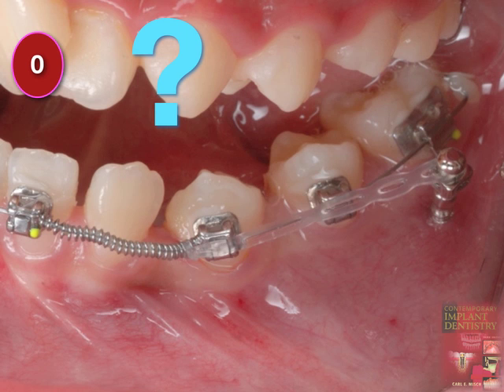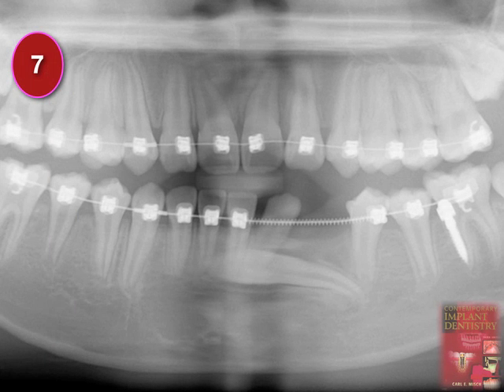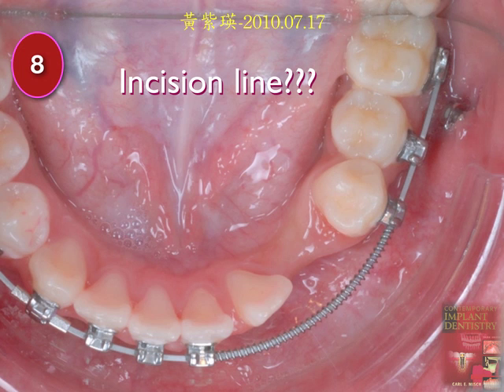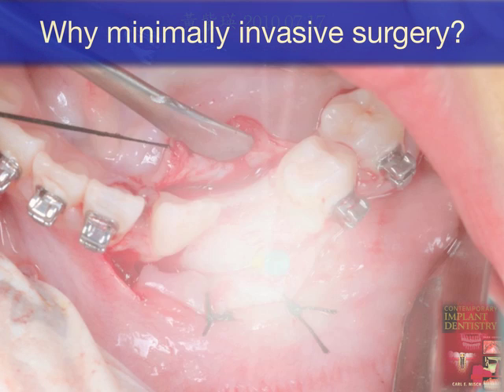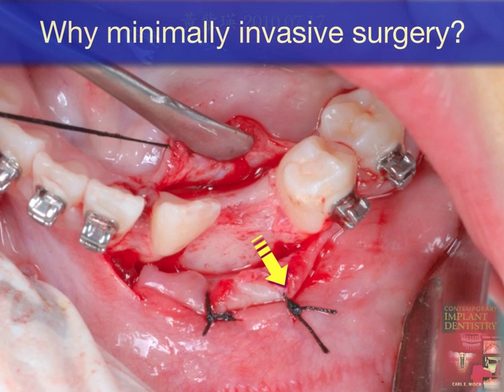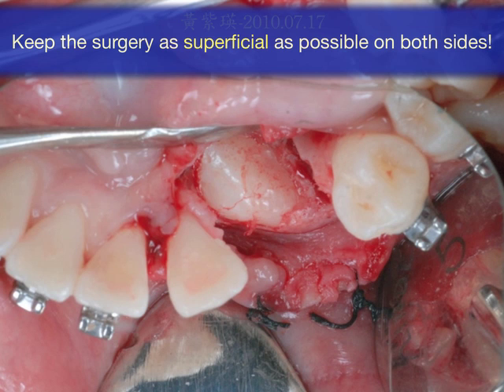Because I am from a poor family, I really need the money. So I go ahead, put on braces, and open up the space right here. I also put a screw right here to try to open the space. 6 months later, I open up the space. I decide to make an incision like this, conservative, and I open the flap, and then I do minimal invasive surgery. Why do I want to do minimal invasive surgery? Because I don't want to mess up that sublingual artery.